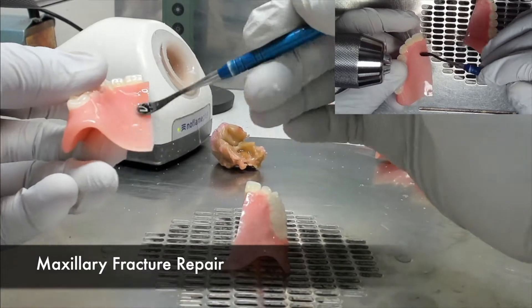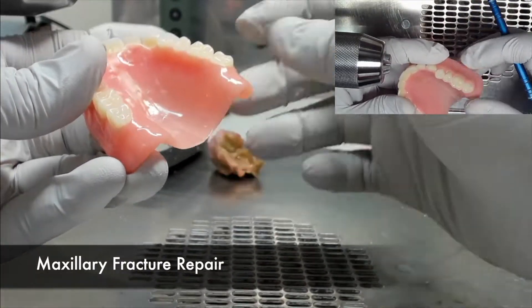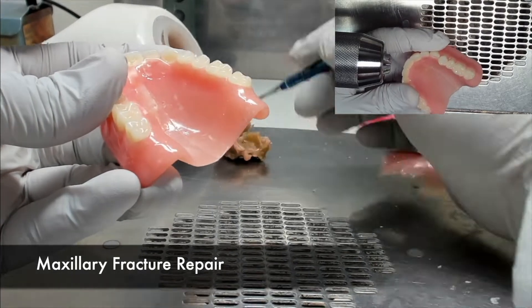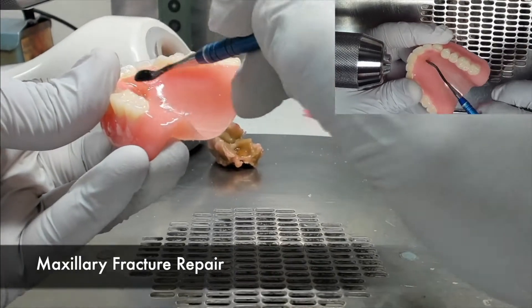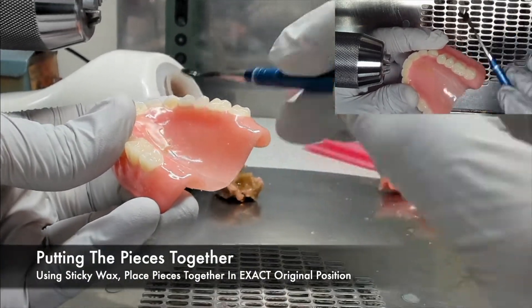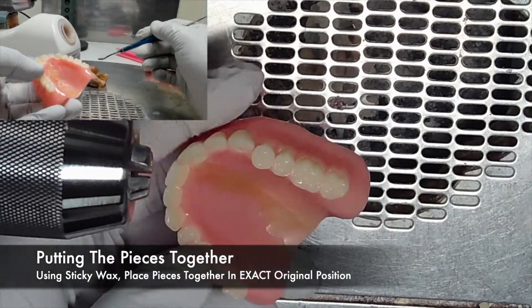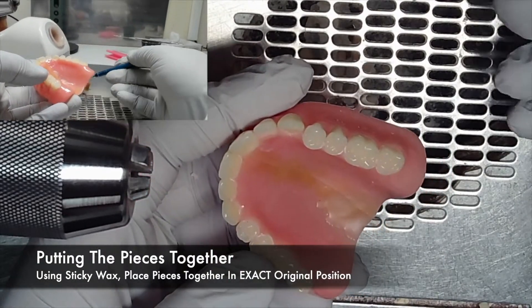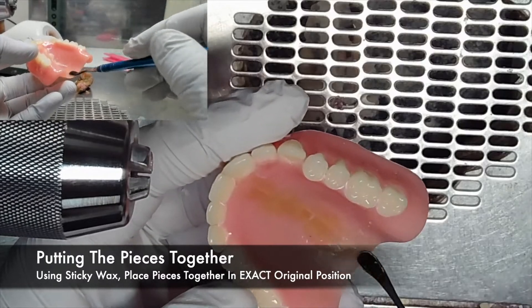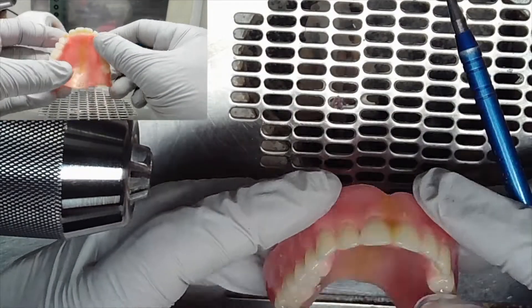We begin with a simple, maybe slightly complex maxillary base fracture. This is a common fracture you will see down the midline of the denture. With the two halves of the denture fitting together like a puzzle piece, you can put these pieces together using sticky wax, but be sure to place them in the exact original positions in respect to one another. If not, the denture will not fit upon insertion.